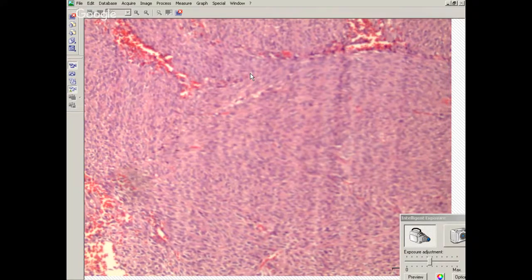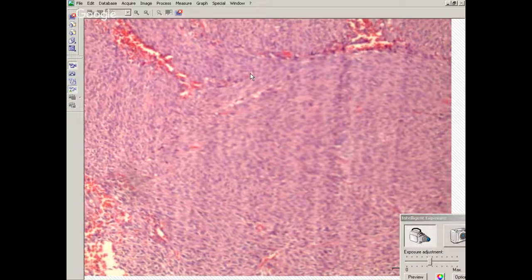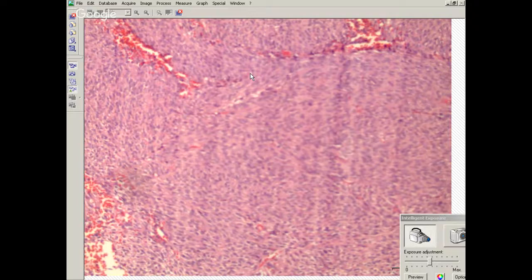So you have melanocytes that are all over the brain. Melanocytomas typically arise in the area of the tentorium, the dura. And you just have to recognize that it's not a meningioma. It's usually a uniform population of melanocytes, no mitotic figures, low proliferation index. They can end up being completely benign, and they can recur. They can transform to an actual melanoma.